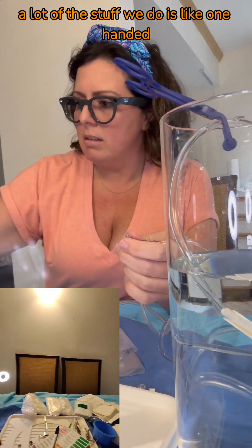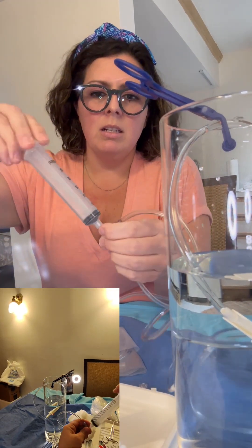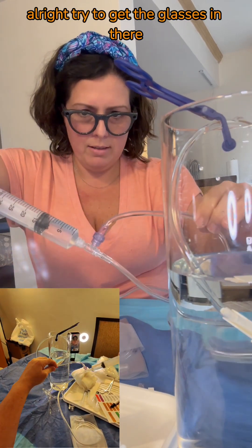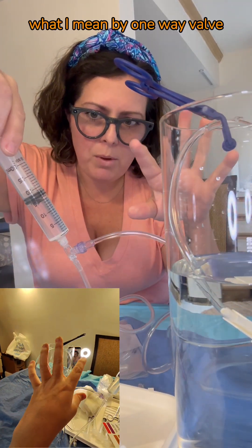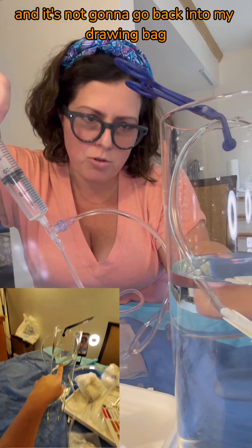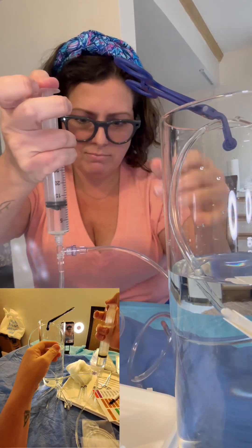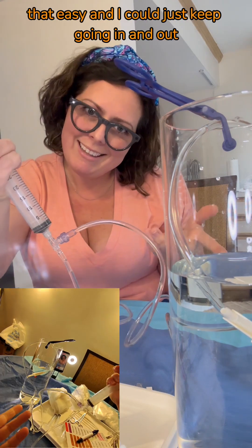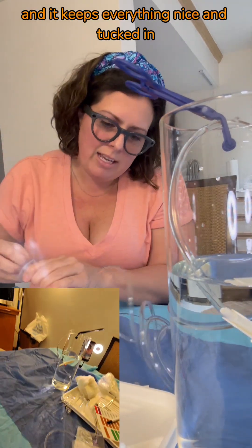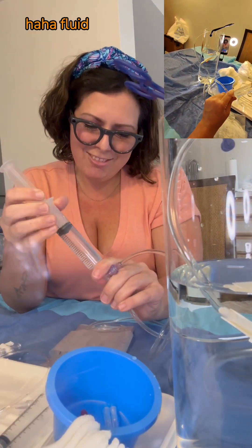A lot of the stuff we do is like one-handed. You get really good at it. Back on we go. I'm going to aspirate. What I mean by one-way valve — I can push this syringe back in and it's not going to go back into my drawing bag, it's going to go into my waste bag. See it going to the bag. That easy, and I can just keep going in and out. It keeps everything nice and tucked in — some fluid out of our little fluid management system.